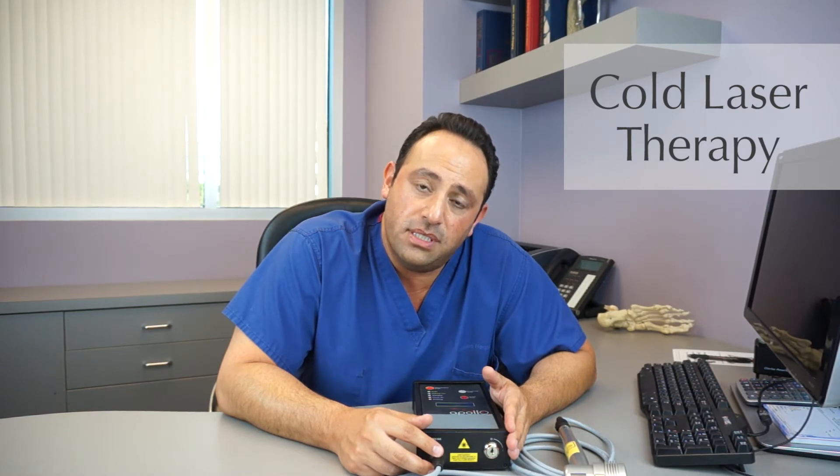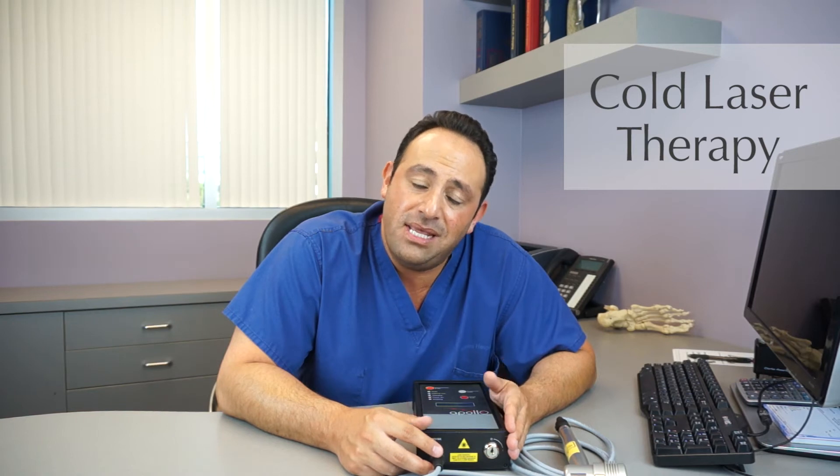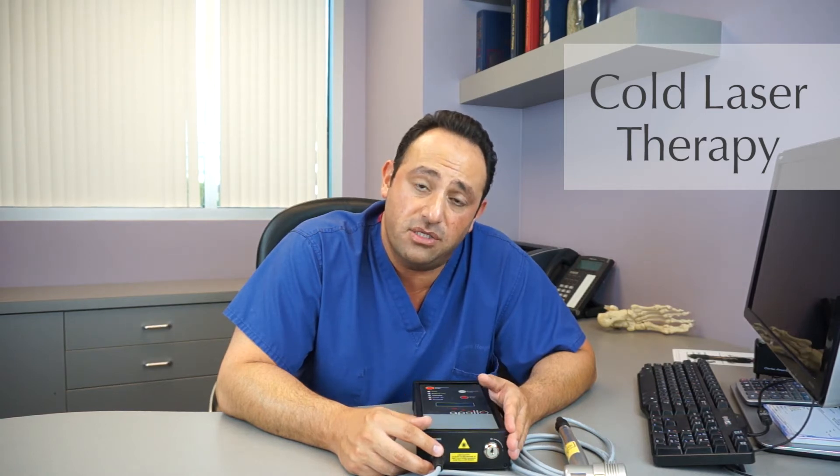Peripheral neuropathy is one of the main conditions that is sometimes not treated by medications, and patients are left trying to seek any kind of alleviation for the pain. The cold heat laser has been used over 3,000 times with benefits and success on these different types of pathologies.